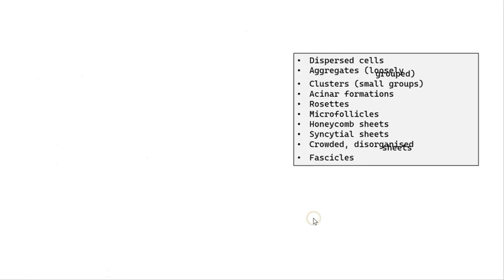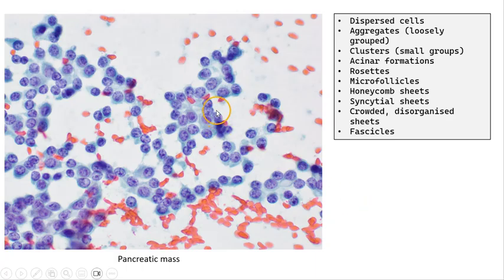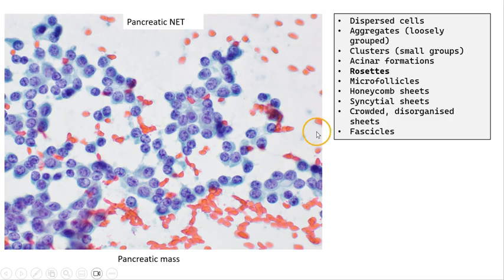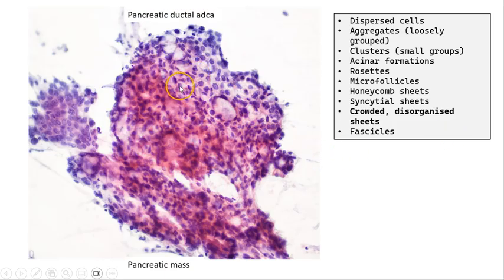Here we have an example of dispersed cells — this is a lymphoma, and often hematolymphoid cells are discohesive, as reflected in this picture. Here is an aspirate of a pancreatic mass where we can describe these formations as rosettes, which is quite a classical finding in pancreatic neuroendocrine tumors. This next aspirate from another pancreatic mass can be described as a crowded, disorganized sheet — we can see that the nuclei are disorganized, with some overlapping and others further apart.